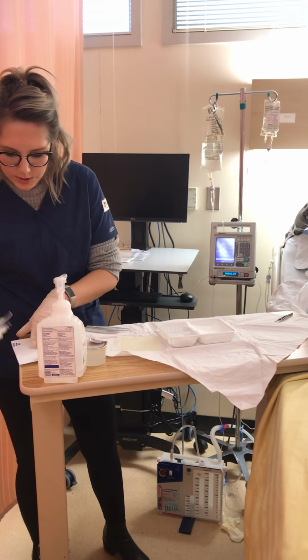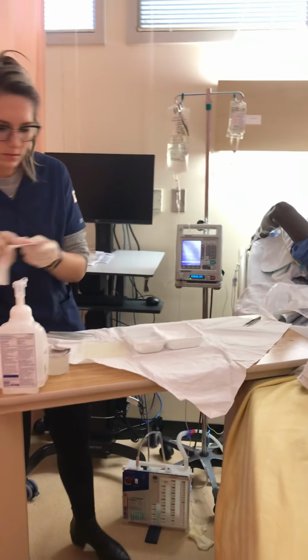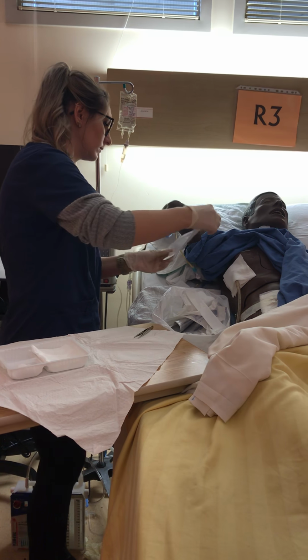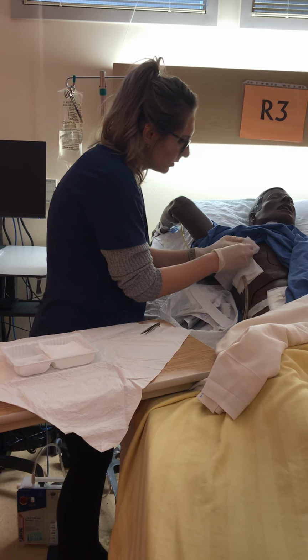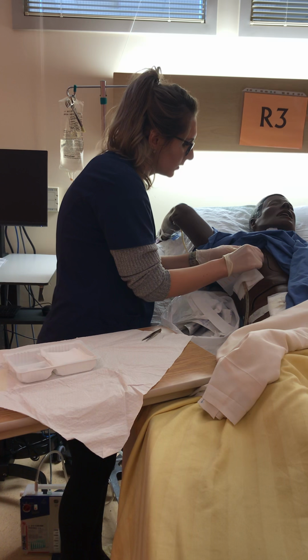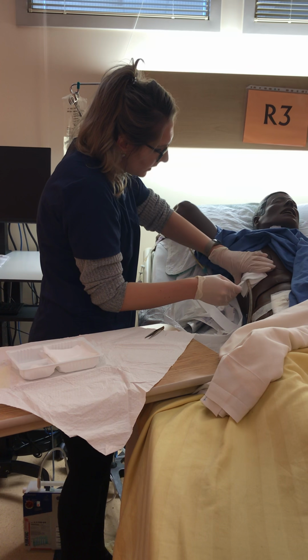I'm just going to grab my e-fix tape, which I've already dated and timed, and put these on the side. Making sure I do not touch the skin, although it's clean. And I'm just going to make a fully occlusive dressing all the way around. Okay, jelonet on. Just make sure this is the dressing site.